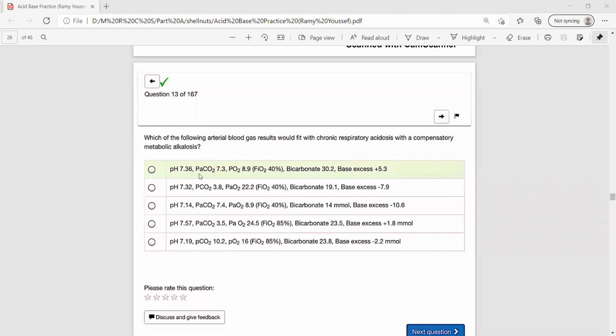In a chronic condition, this is the picture. You'll find the pH normal, between 7.35 and 7.44, but just close to acidosis. The body compensation just pushes it to the safe area and then leaves it. And CO2 will be high.